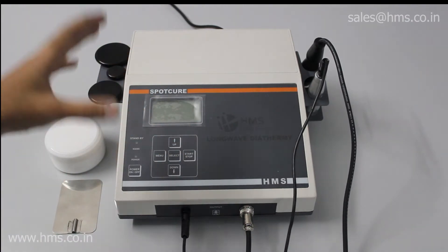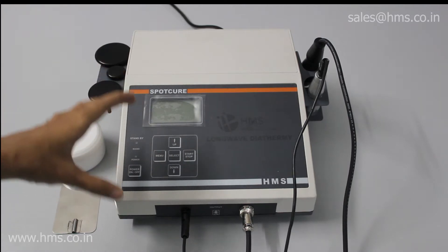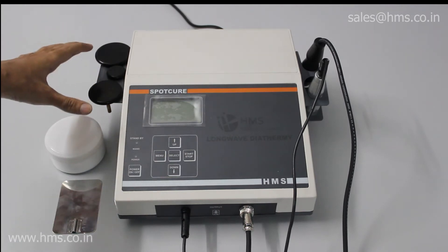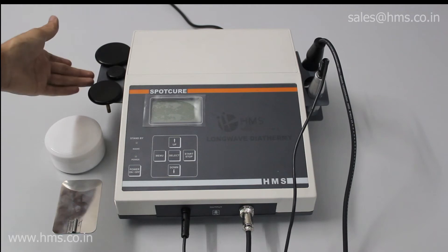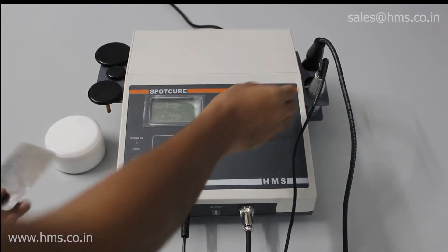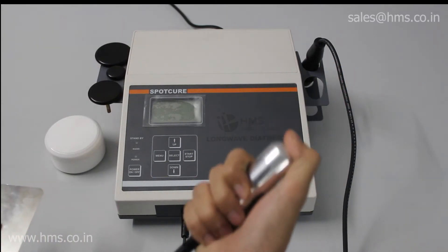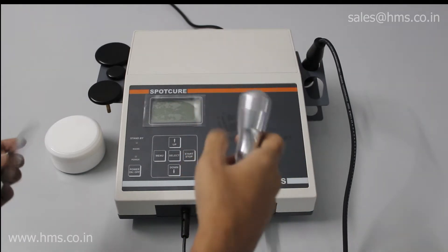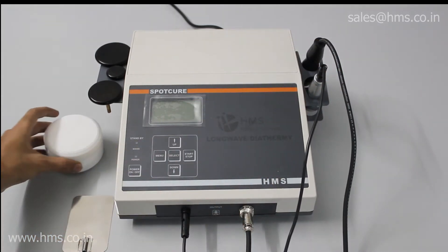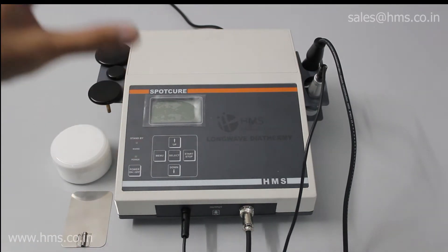Now we'll go over the X series accessories which come along with the Spot Cure when you buy it. We give you three different applicators with different sizes, and we also give a stand for you to place the applicator. You also get two different kinds of inactive probes — one is a flat plate and one is a handheld probe for when you give treatment to the patient on their hand. You also get the treatment gel along with the equipment.